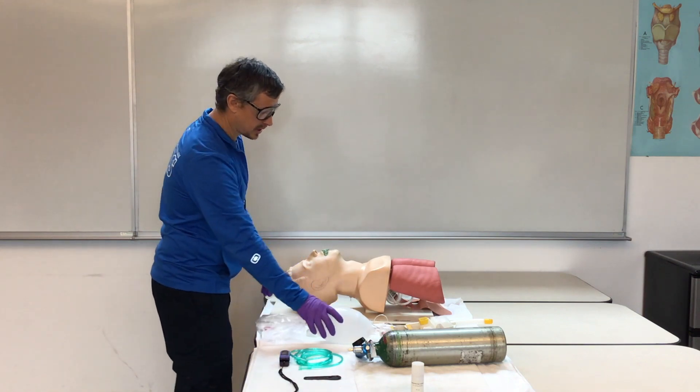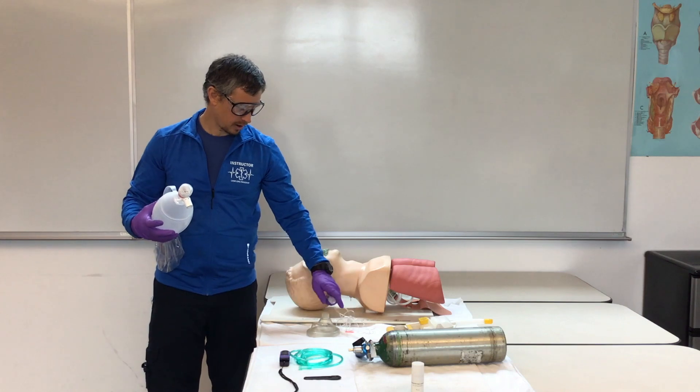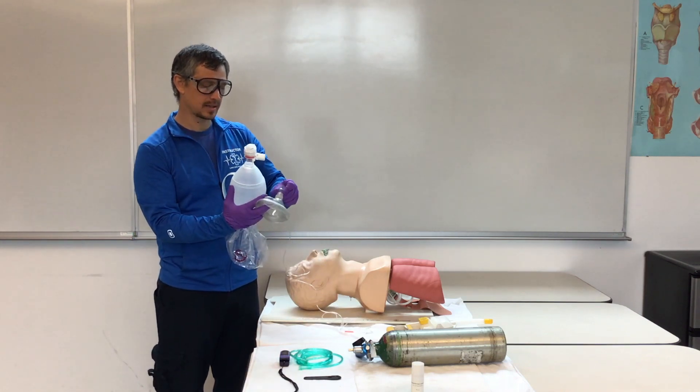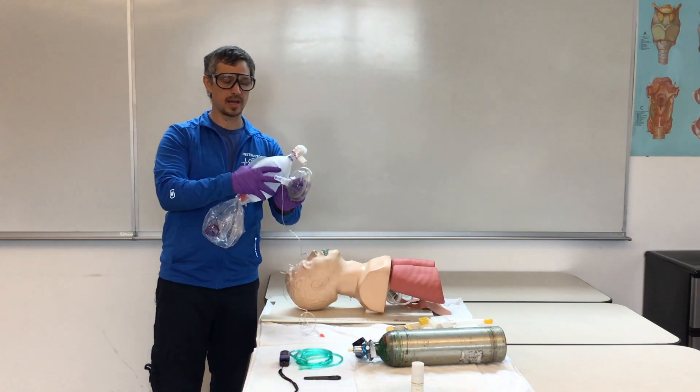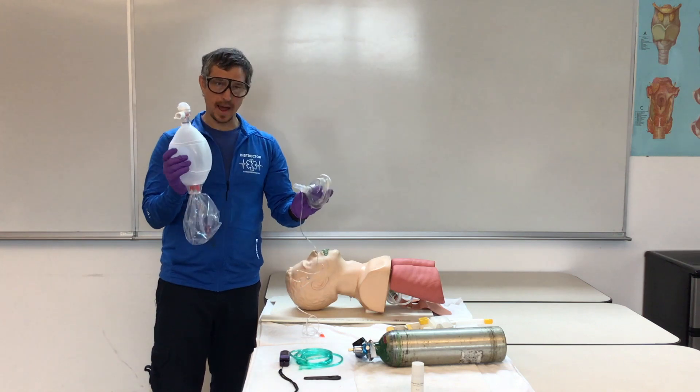Then we're going to take our BVM and attach our capnography, which is going to measure our end-tidal CO2. It goes in between the mask and our bag valve.